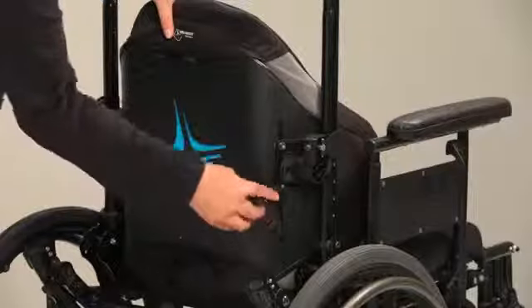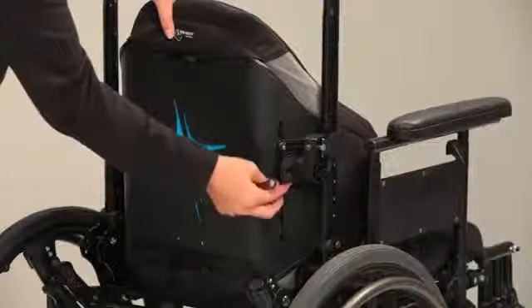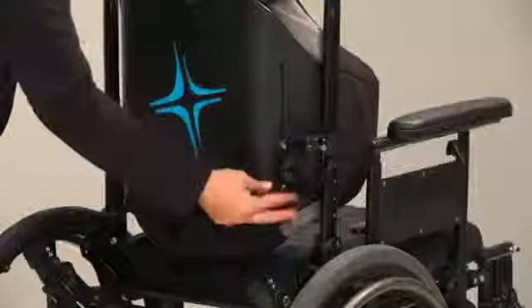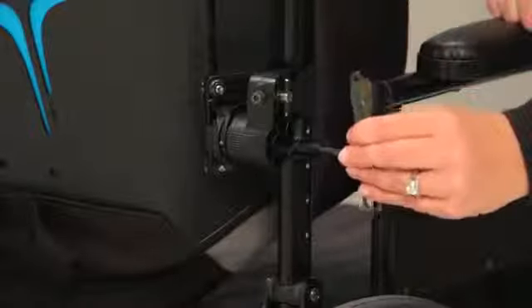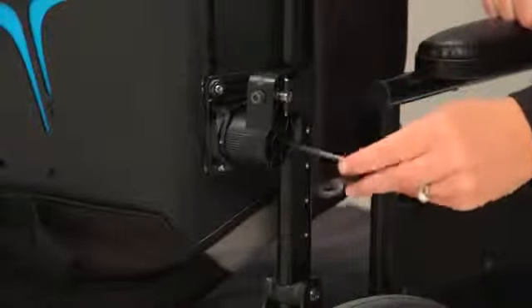Loosen the nuts on the width and height adjustment bolts with the box end wrench. Slide the back shell up and down in the vertical slots until the desired height is achieved. Tighten the nuts on the width and height adjustment bolts with a box end wrench until snug, plus a quarter turn. To adjust the seat depth, loosen the adjustment bolt approximately 3 full rotations.